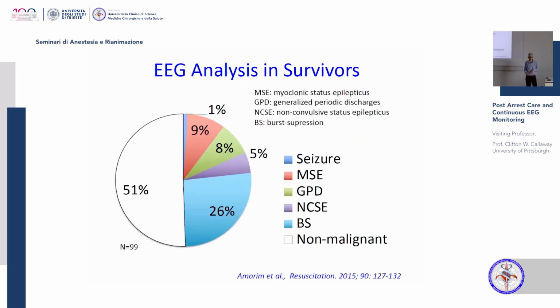Who survives? Well, it's much better to have been the person with a continuous EEG. So the initial patterns here, you can see among survivors, 50% of the survivors have continuous EEG at the beginning. People with seizures also survive, but those other patterns, those GPEDs and suppressed background, those are the really lethal, malignant patterns, the ones where few of our patients who are leaving the hospital started out with those malignant patterns.